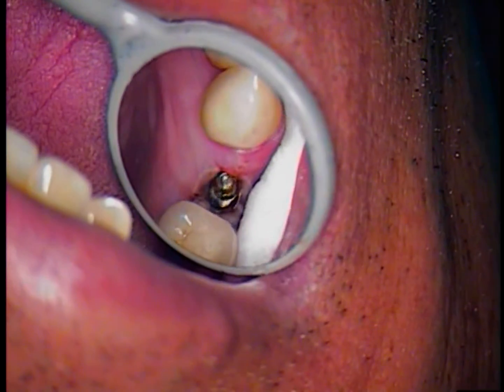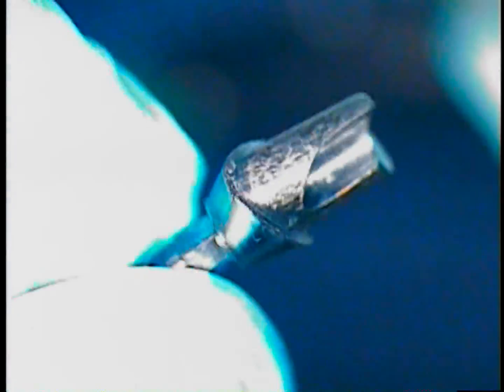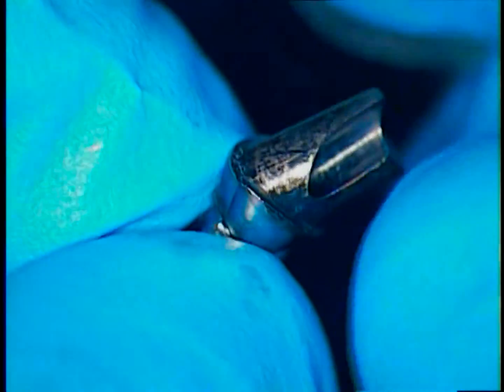Hello and welcome back. This is Dr. Jerry Cuomo. I'm filming live out of my private office here in Boca Raton, Florida. This is a Biomet 3i custom abutment — it's called Certain Prevail.